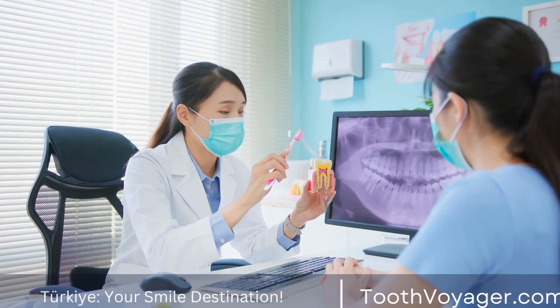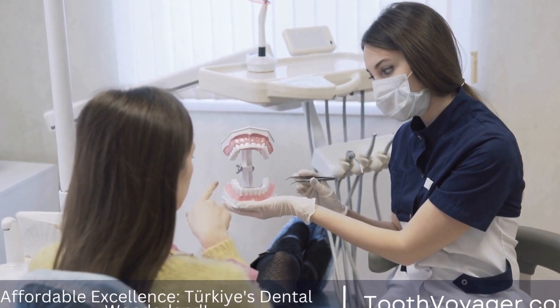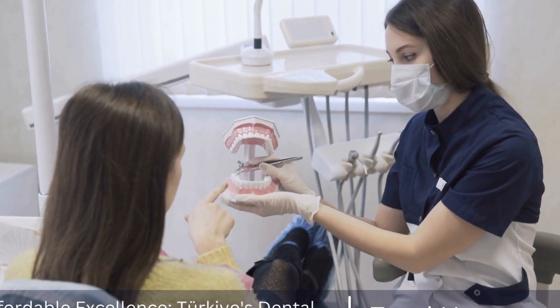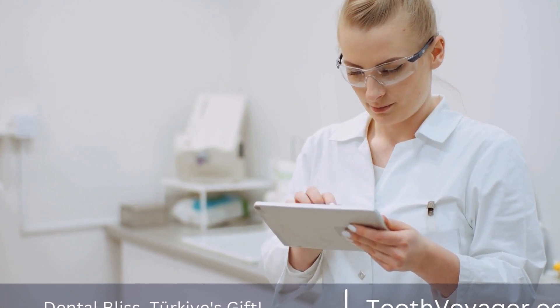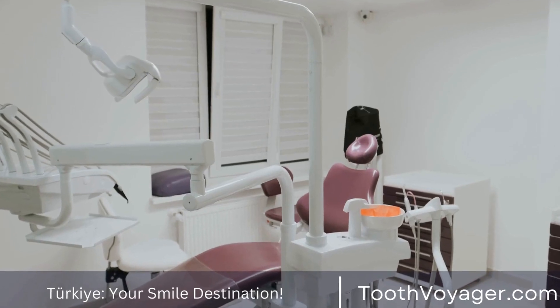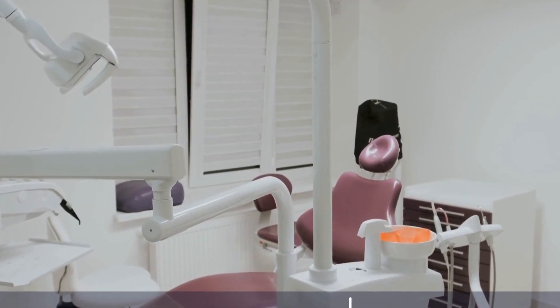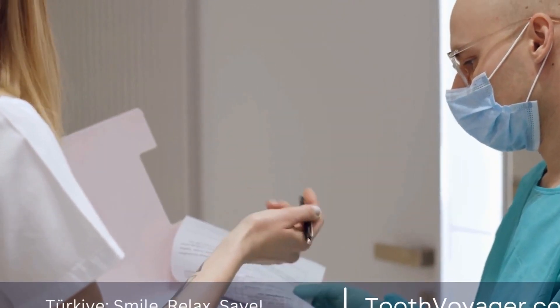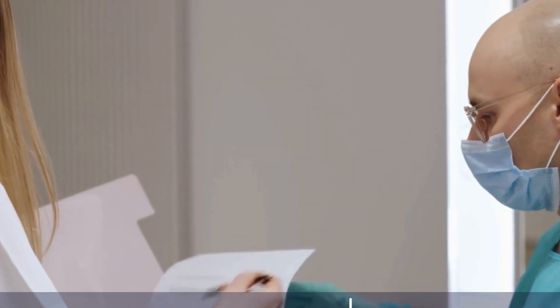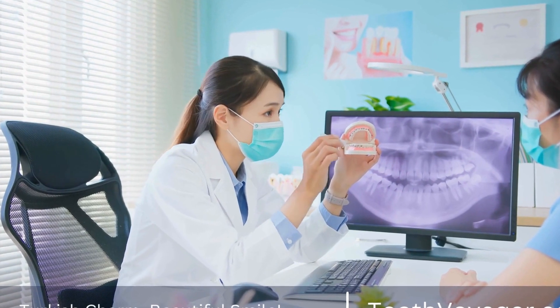Safety and risks of dental x-rays. Although dental x-rays are a valuable tool in dentistry, they also carry some risks associated with radiation exposure. However, modern x-ray machines use minimal radiation doses, making them safe for patients. Dentists take precautions, such as using lead aprons and thyroid collars, to minimize radiation exposure during x-ray procedures. It is essential for patients to inform their dentists about their medical history, including any previous x-rays or radiation exposure, to ensure safe imaging practices. Pregnant women should also inform their dentists about their pregnancy to avoid unnecessary x-rays during this time.